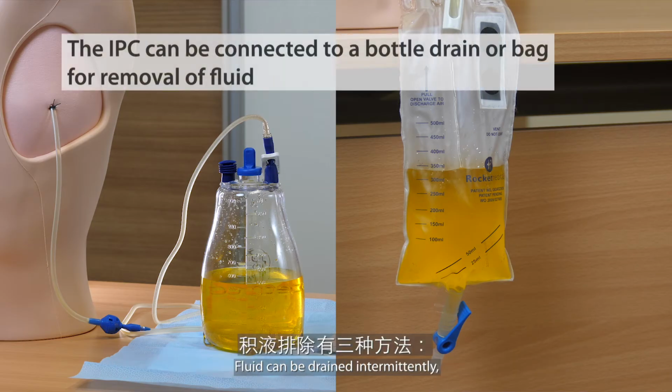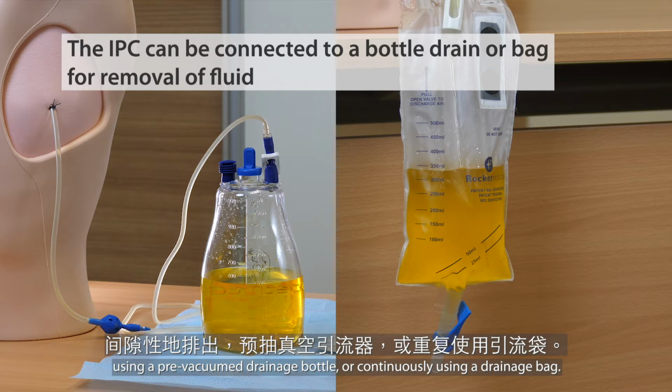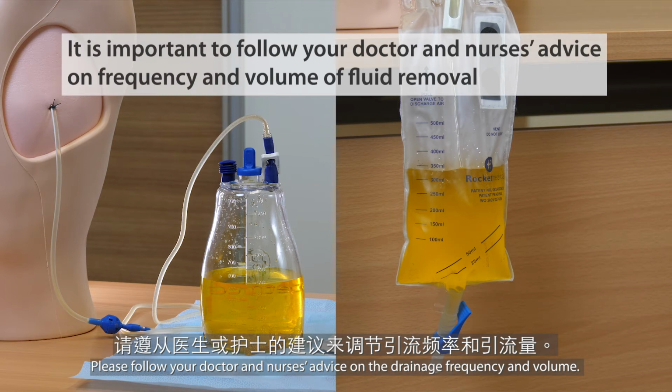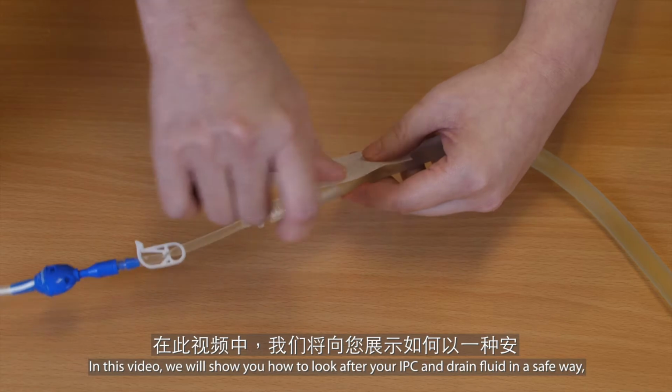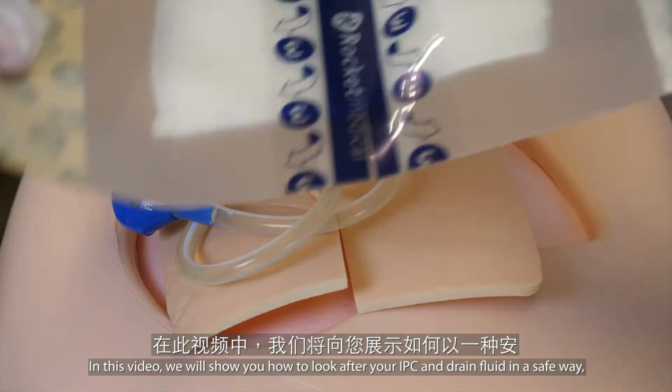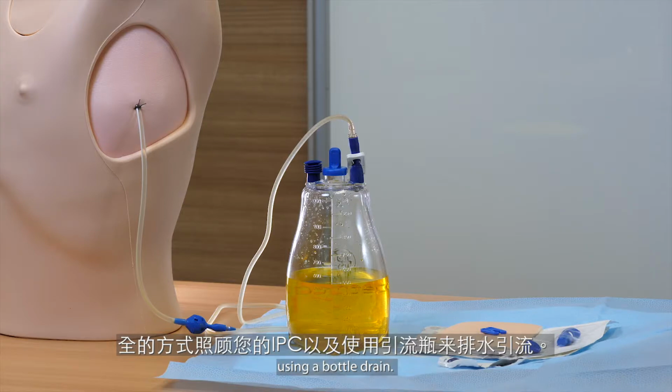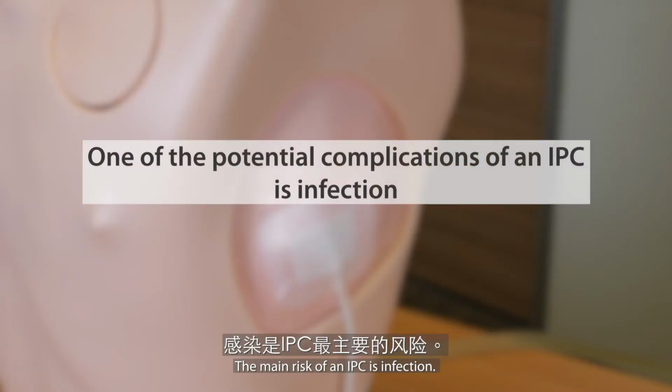Fluid can be drained intermittently using a pre-vacuumed drainage bottle or continuously using a drainage bag. Please follow your doctor and nurse's advice on the drainage frequency and volume. In this video, we will show you how to look after your IPC and drain fluid in a safe way using a bottle drain. The main risk of an IPC is infection.